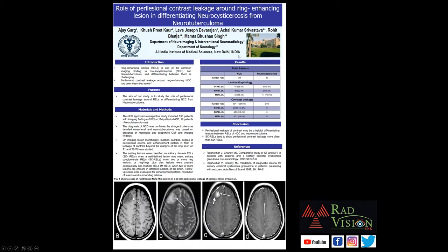Recently, a poster presented at ASNR also demonstrated the importance of perilesional contrast leakage around ring enhancing lesions in differentiating NCC from tuberculoma. This is another right frontal NCC case showing T2 hyperintense lesion with perilesional vasogenic edema and typical perilesional contrast leakage around conglomerate ring enhancing lesions, confirming NCC.